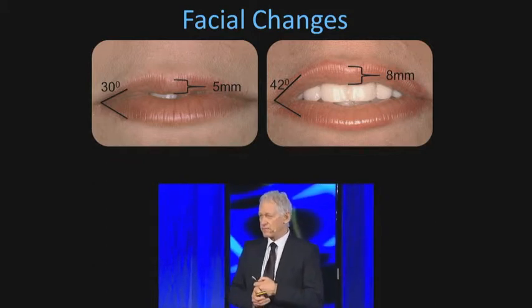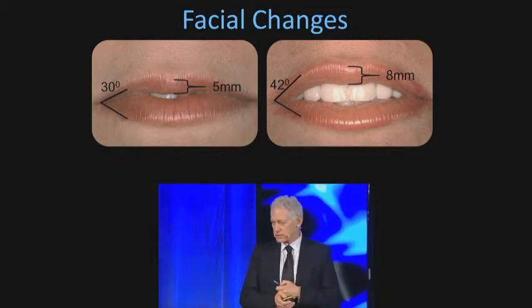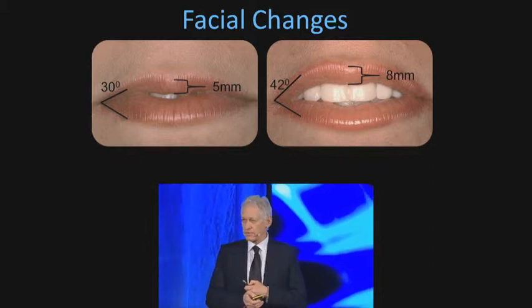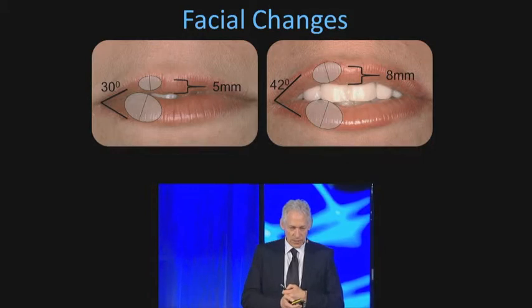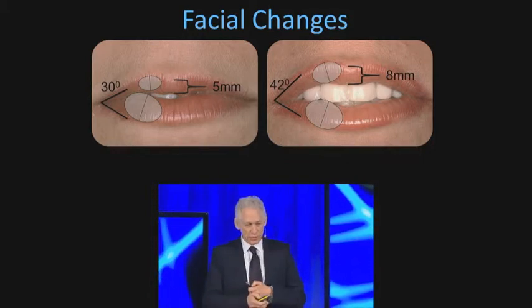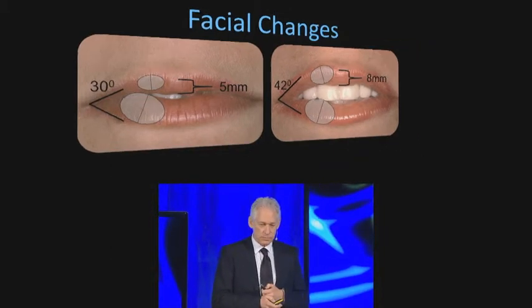Ideal is 45. So we can reconstruct all this loss of tissue and improve facial appearance just by reconstructing the anterior region, placing implants. Remember those Fabergé eggs? They've changed dramatically. Look at the upper and the lower pre-op and post-op.